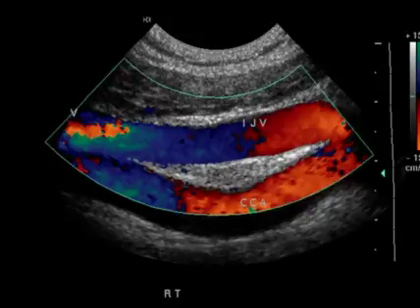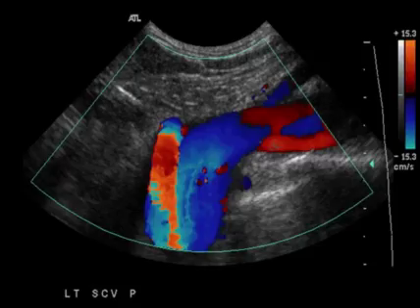And of course, as I mentioned, looking for the junction of the internal jugular vein with the subclavian vein, these very small footprint transducers with a fan-shaped array or visualization of the vessels can actually be beneficial and get us way down into the chest, which would otherwise be impossible using a linear probe.